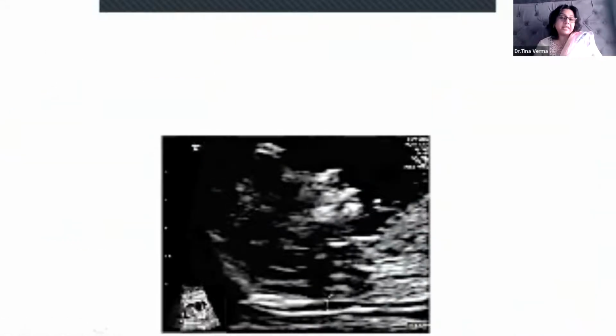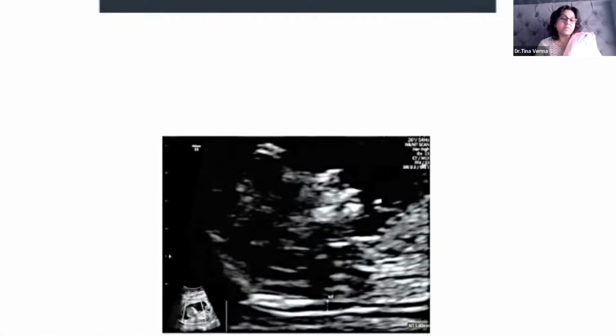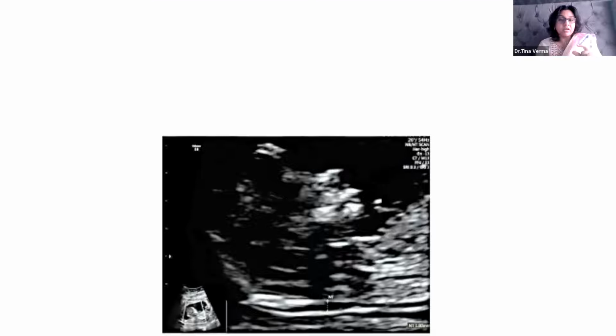Now, this is a historical image of nuchal translucency, which Kypros Nicolaides has been explaining to us for the past 2 decades. This is a zoomed image of the fetal head and the thorax in the mid-sagittal section. We can see the nasal bone here and we can see NT here. So this is what, till now, we were all asking the person performing the first trimester screening to see. Now, how can we extrapolate information from this single image?